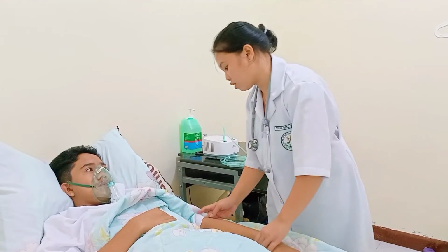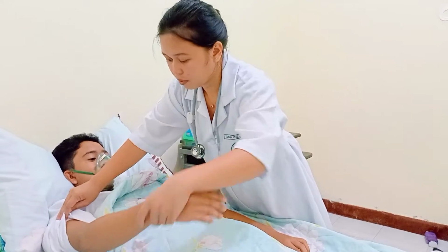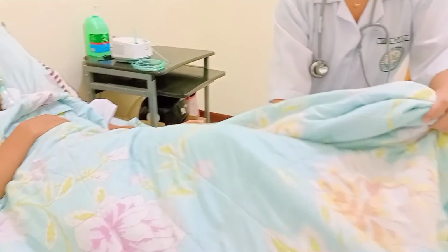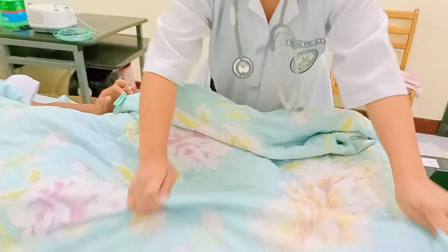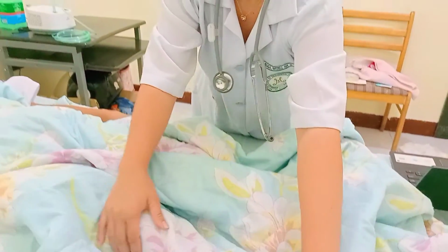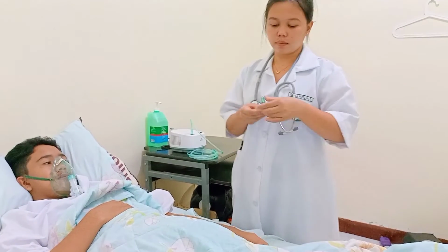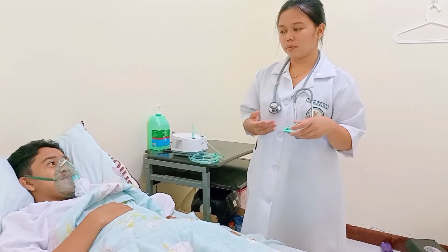Then sir, I want to check the skin color in your upper and lower extremities. The rationale for this is to determine the effectiveness of the procedure.